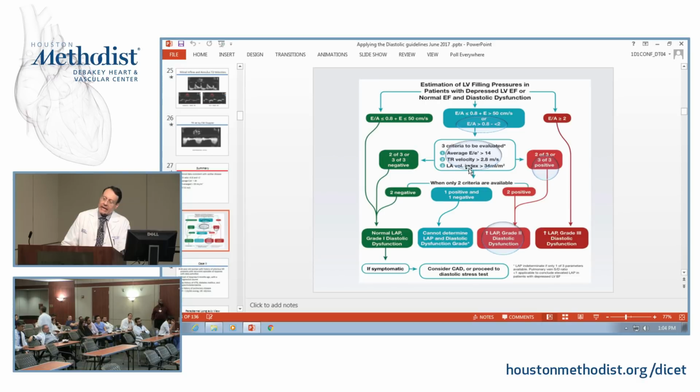Right. The pure diastologist would rather put more confidence in the diastolic velocities themselves, such as pulmonary vein, mitral, and tissue Doppler, as opposed to circumstantial evidence. But having said that, that was tested in a large multi-center study, 450 plus patients, and the accuracy is decent when you just use these two signals. But again, in the proper context, so you need to know whether you are looking at a patient with heart disease or not. Okay. Thank you all.